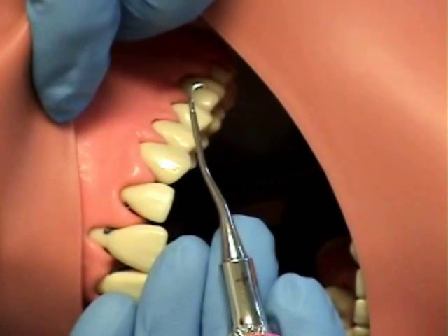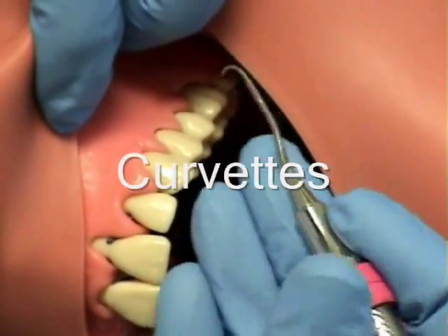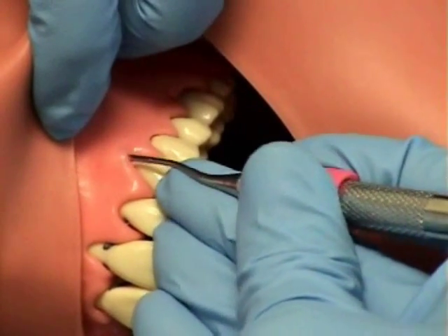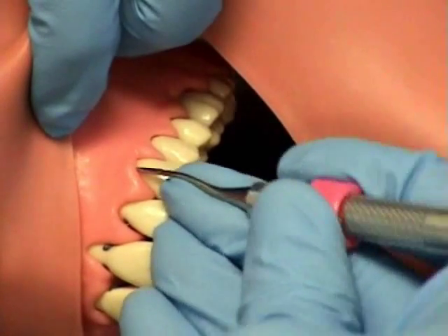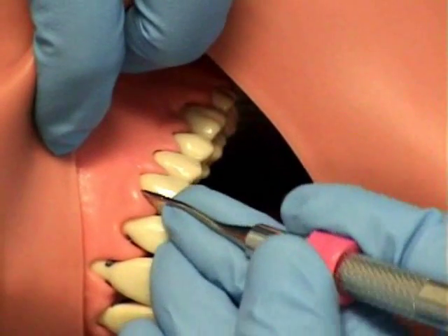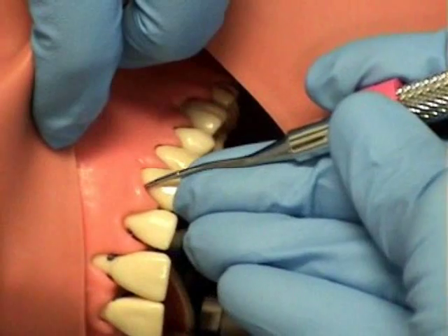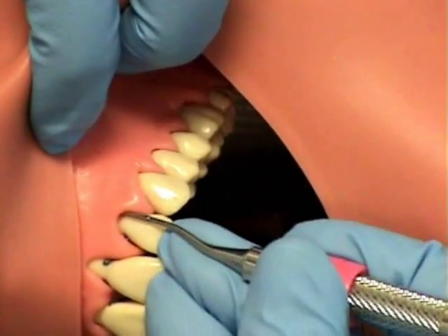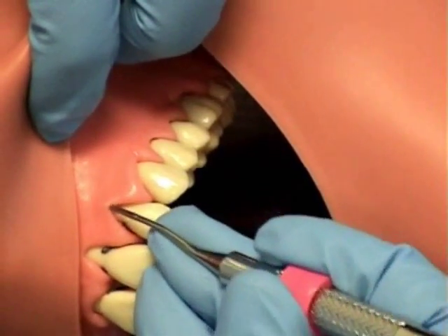Another set of advanced instruments that was designed by Barbara Long are the Vision curvettes. There is a set of 4 curvettes, a Sub-Zero, a 1-2, an 11-12, and a 13-14. This has a 50% shorter blade and provides better adaptation on narrow root surfaces and tight periodontal pockets. It has a balanced blade tip in direct alignment with the handle. The blade tip is perpendicular to the handle and the shank is closer to parallel with the handle.